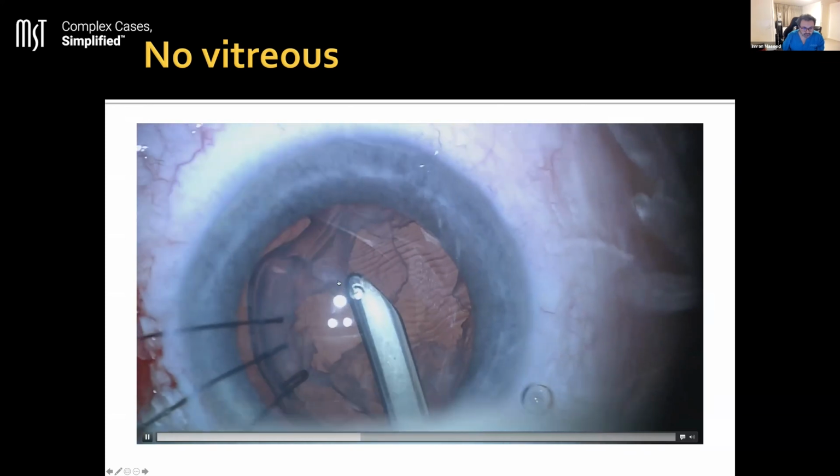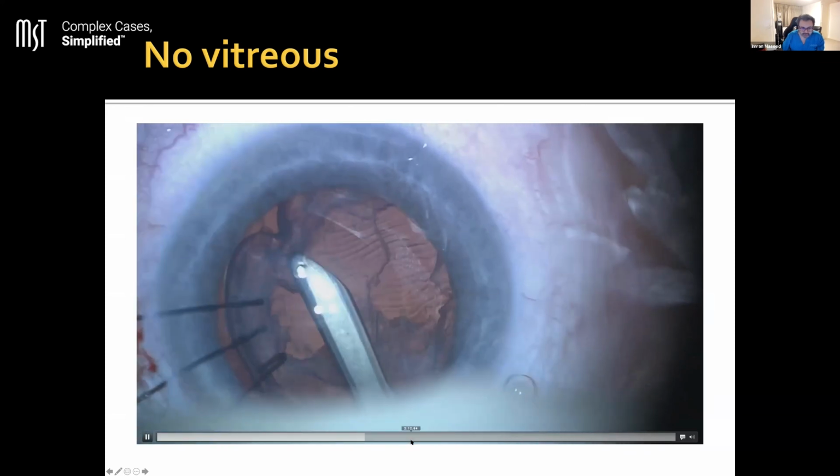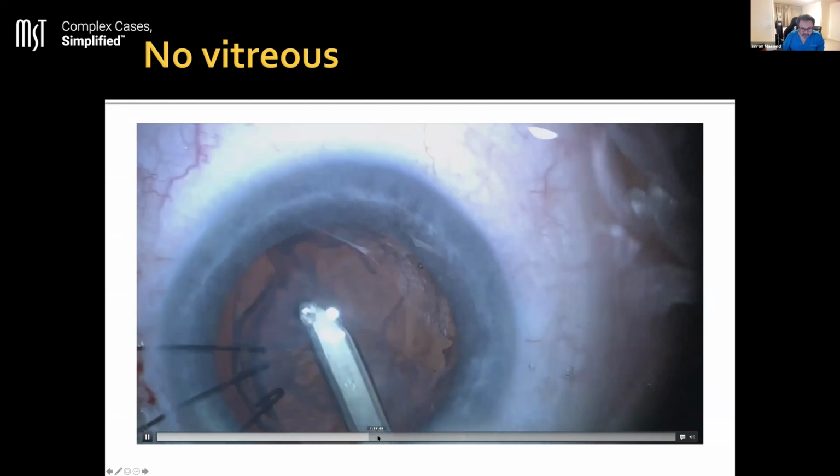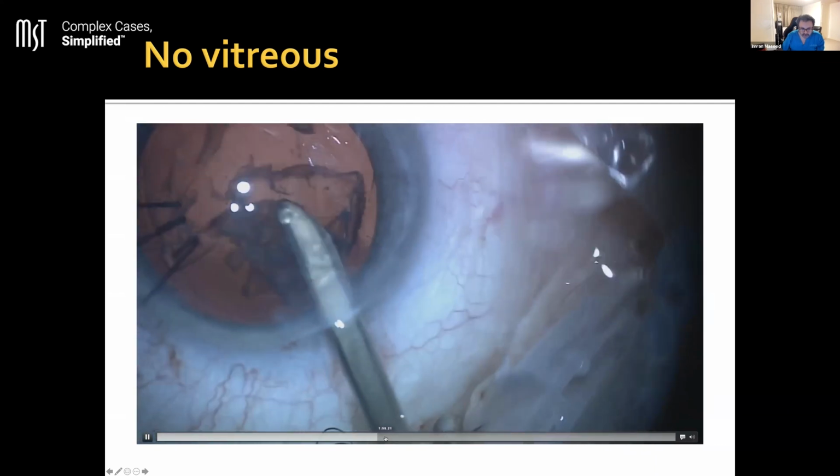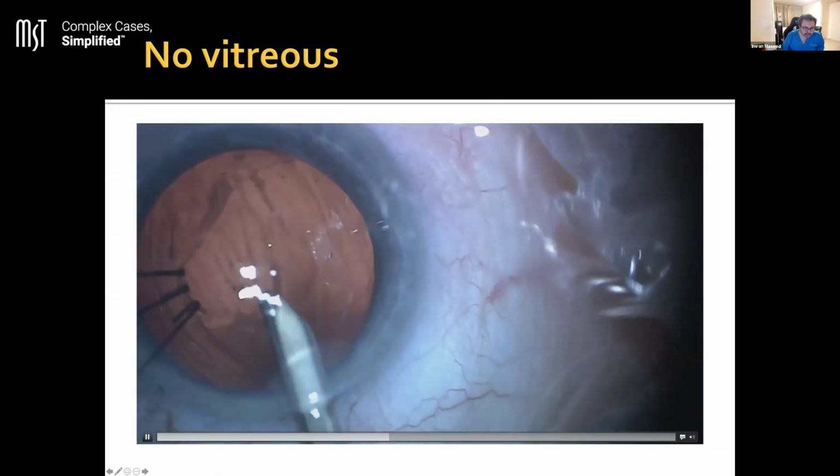And again, I'm going to use a Simcoe here because I think this is a little bit more gentle on the capsule, particularly when you've got these sort of zonular issues. So we'll just move forward here. Now we've got the cataract out.